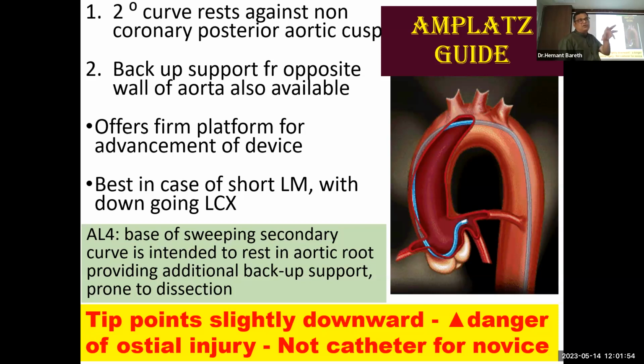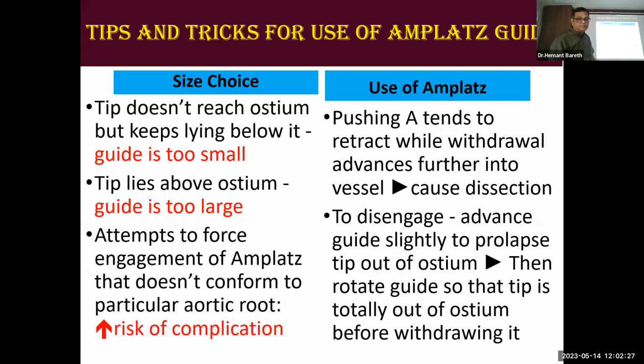For beginners, what they do is focus on the lesion only, and they don't keep looking at what the distal tip of the guide wire is doing, or what the guide catheter is doing, because they are just focused on that area and not looking at how the guide catheter is moving and how it is injuring the left main, or what the distal wire is doing, whether it is going into a side branch, whether it's perforating that branch. So these are the important things. So this kind of catheter is for an advanced operator.